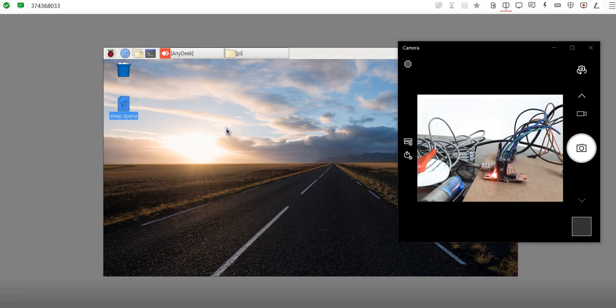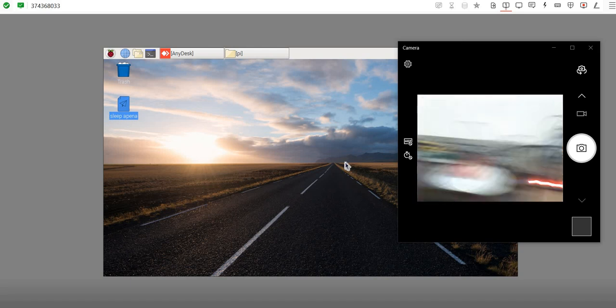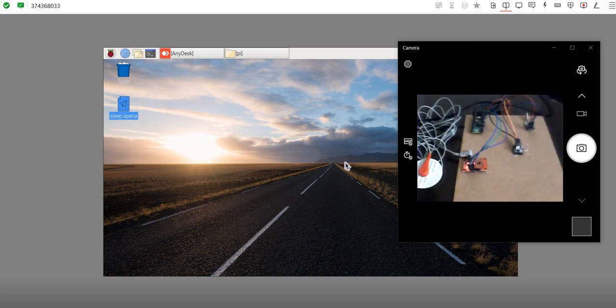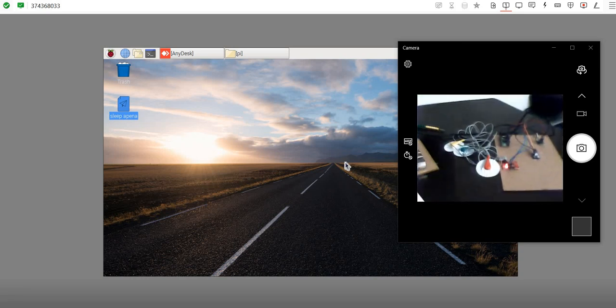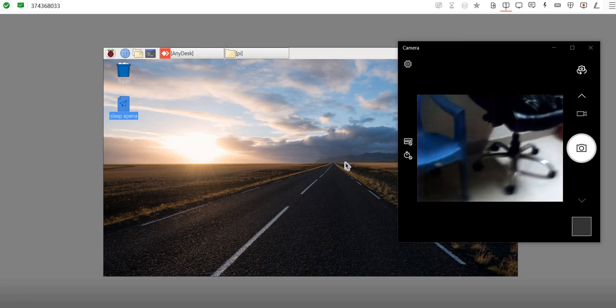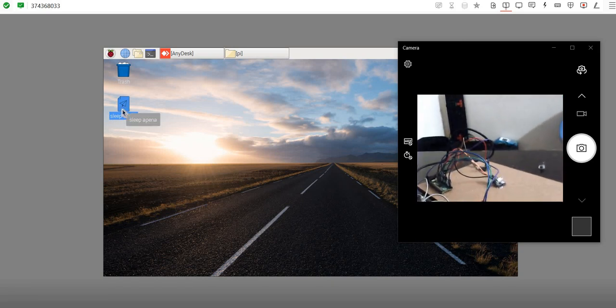So after doing the initial setup and everything, on the desktop you will have an icon called Sleep Apnea, and here you will be having your kit with the Raspberry Pi, and thereafter you will have a kit with the your section of this thing, and both will be connected through wireless. Okay, so after this process is done, first initially what you have to do is double click on this icon.